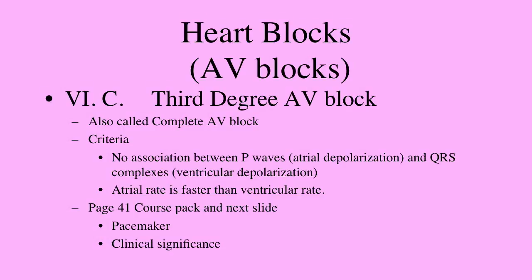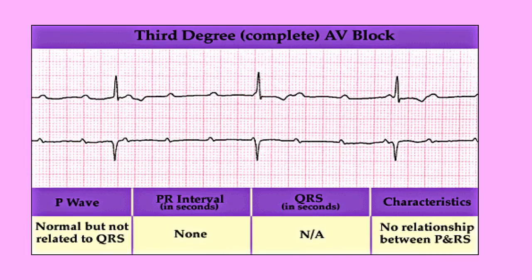You can go through and see where the P waves are. One of the things that makes this fairly easy to see is the idea of lost and found P waves, where you can see them and then they get lost, or absorbed basically, by the QRS complex. If you look at the next slide, you can see at the top, and we'll come back to the previous slide in a second, a P wave to the far left, and then another one, and then another one right after the QRS complex, and then a couple more in the middle of beats, and then you have one in the QRS complex.